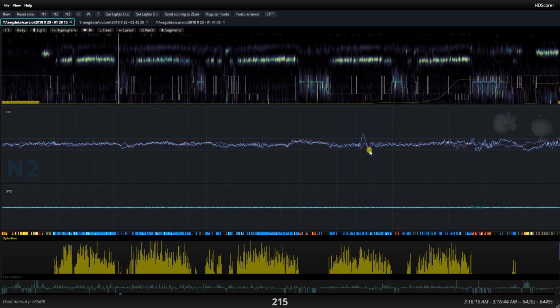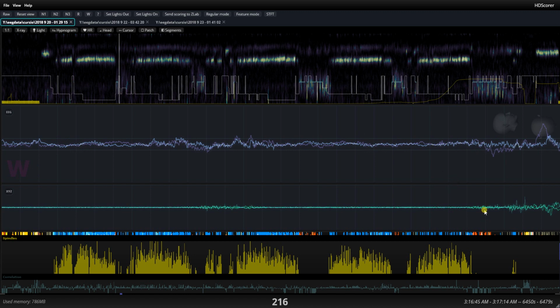This looks like a genuine K complex. And then here we got wake simply because of the movement. Now there's one thing that I'd like to state is that on the AASM guidelines, they score wake when there's a major body movement accompanied by alpha waves. A major body movement without alpha waves is still considered as whatever epoch came before it, unless there's a wake epoch near it. Very convoluted rules, not really biologically substantiated, kind of like just a convention.